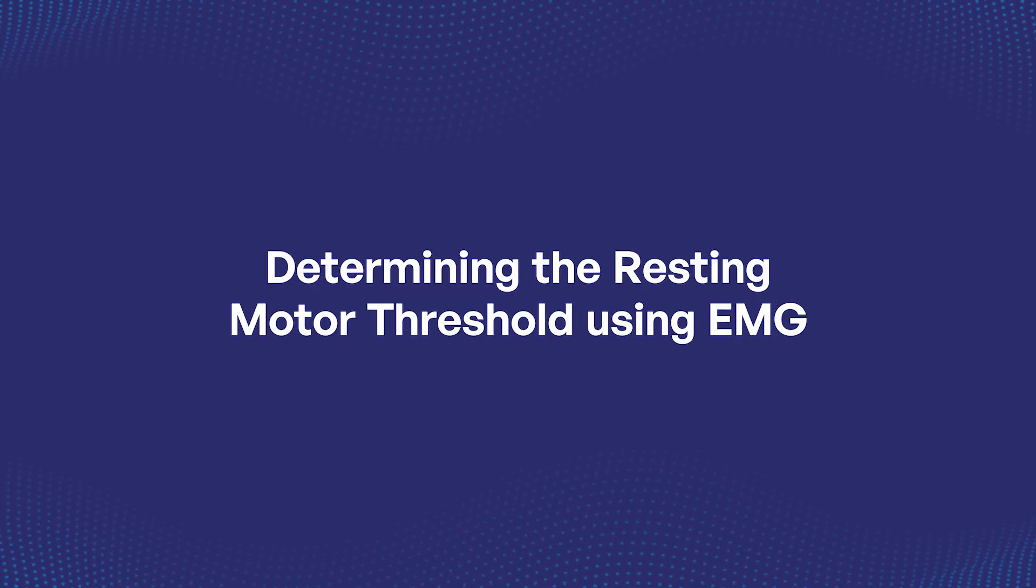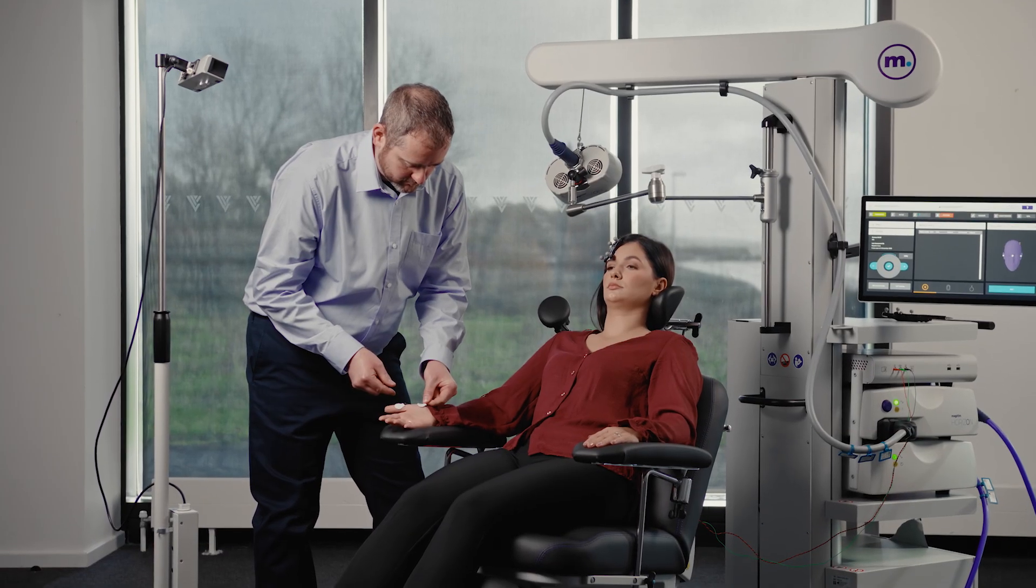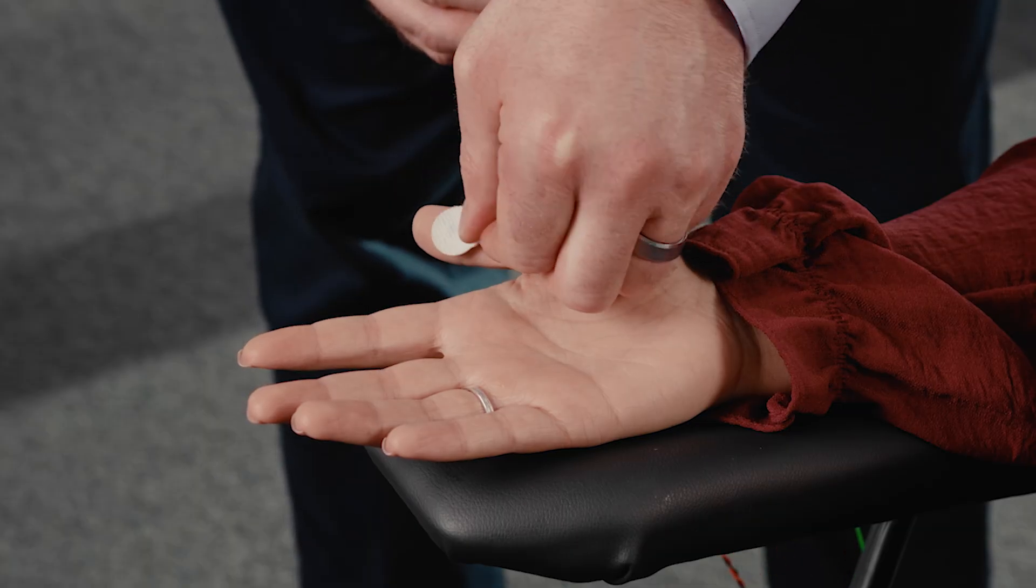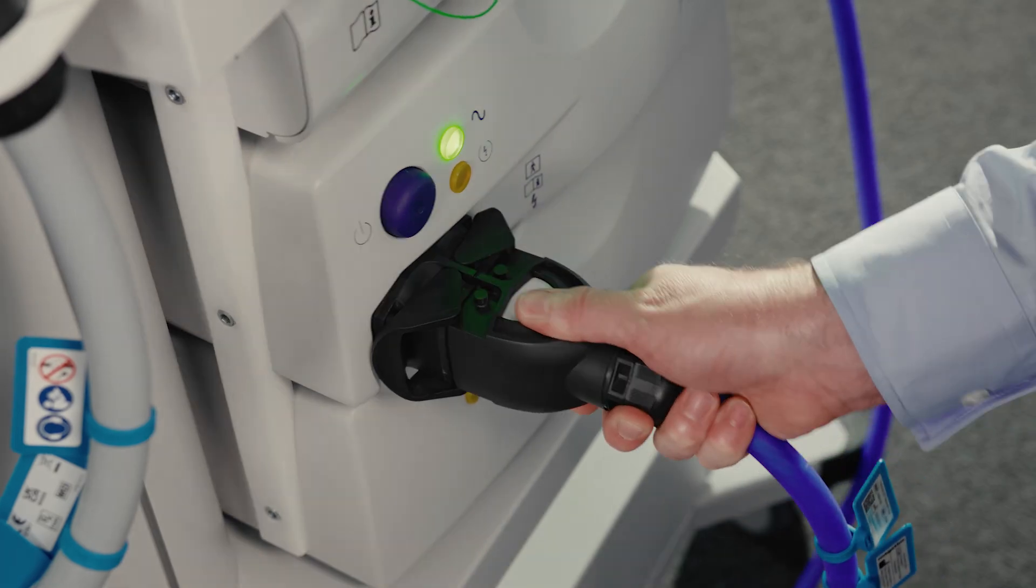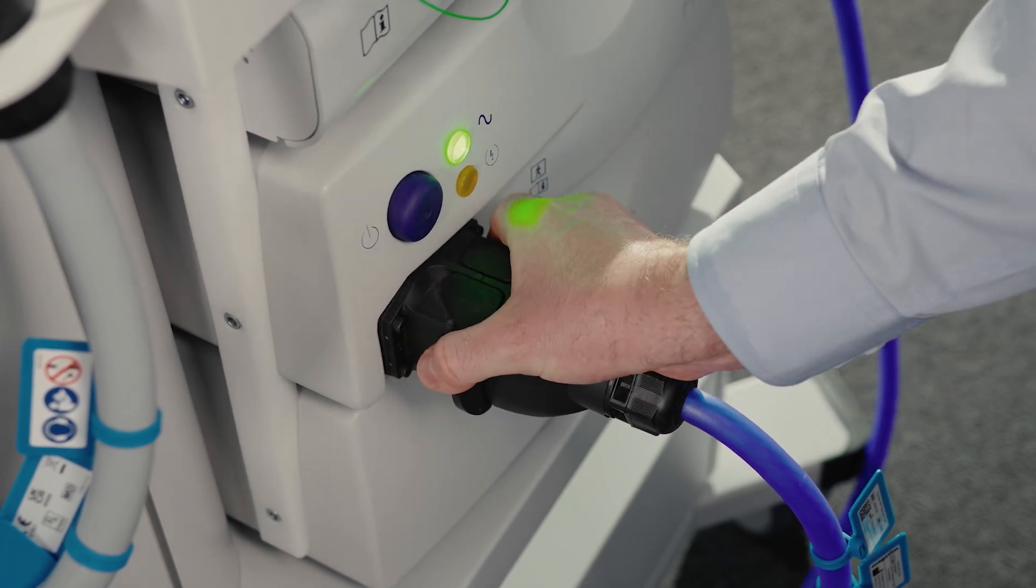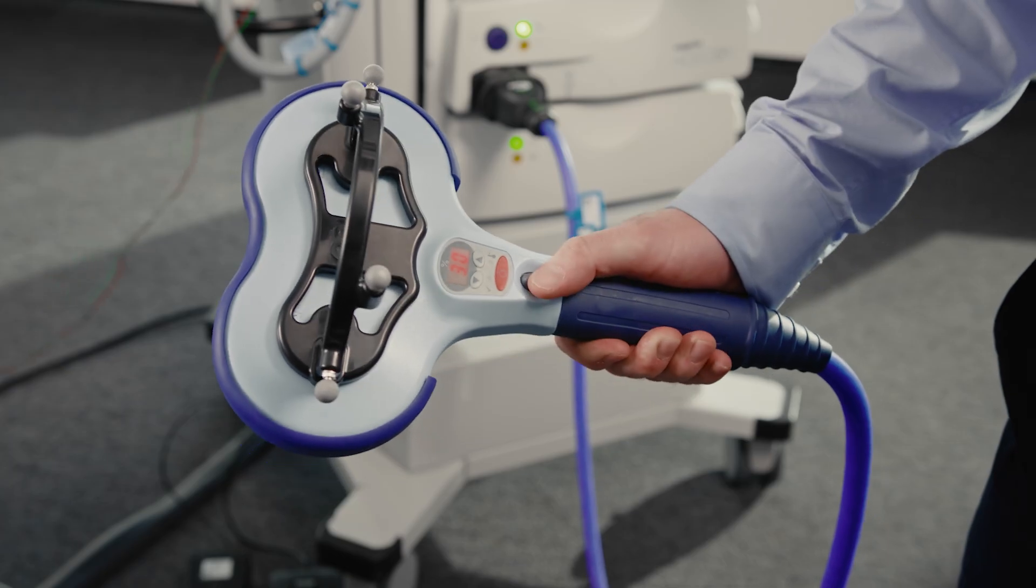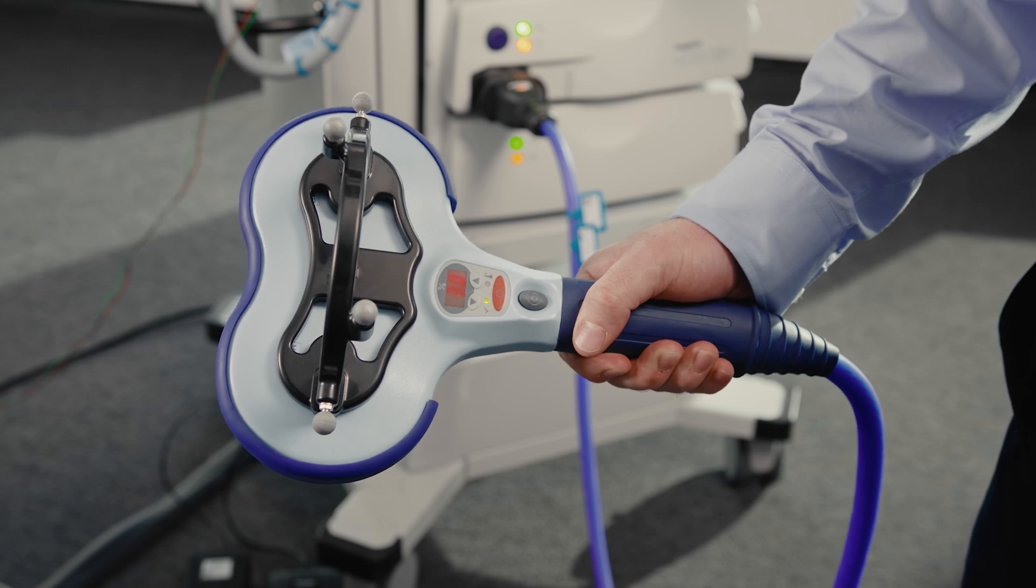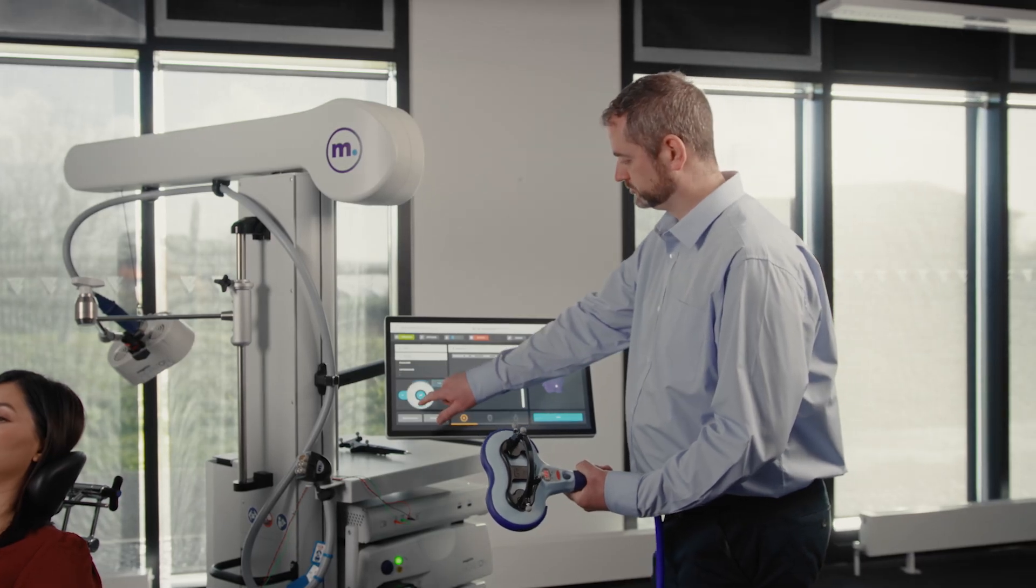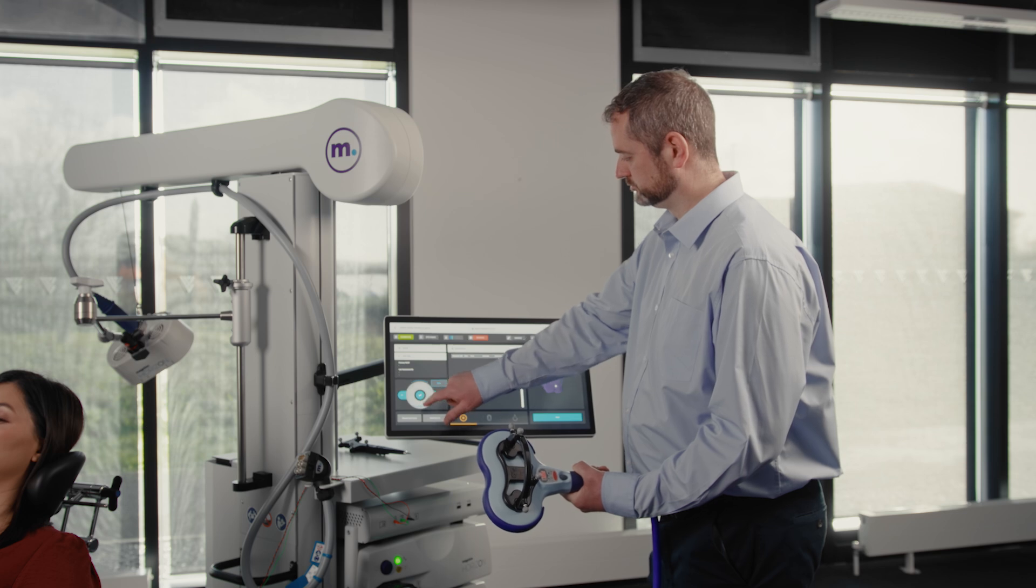Determining the Resting Motor Threshold Using EMG Motor Cortex Sensitivity: Position the patient with arms resting on the chair armrests. Attach the EMG electrodes. With the Horizon MT coil connected, press and hold one multifunction button to charge the system. Set the power output to 50% on the Horizon UI or MT coil control interface.